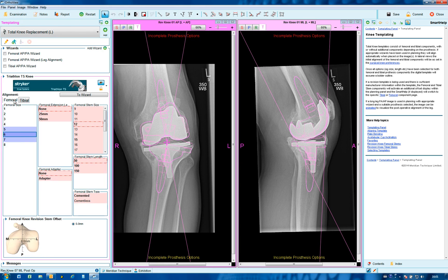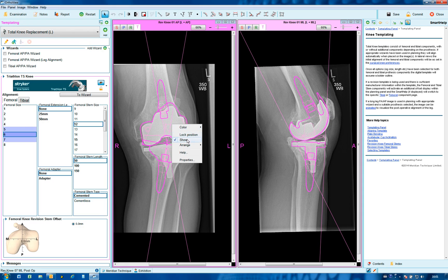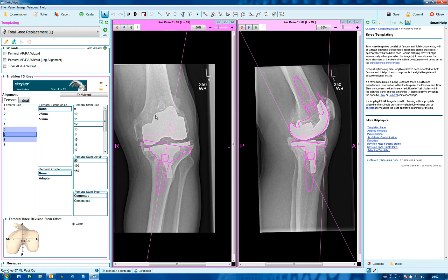Choose the femoral component and also select something in each box to complete the template. Templates appear on the screen, and if no femoral component needs to be revised it can be hidden by right-clicking and choosing show — just to make it easier to view the changes in the tibial component. To return it to the screen, just choose show with the icon next to the properties menu.